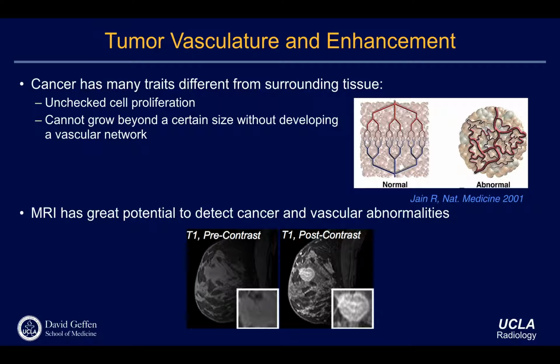Right, that's roughly right. The main idea is that whenever you have a shorter T1, it recovers faster in the longitudinal magnetization. Using a T1 weighted image, a higher signal means much more recovery of the longitudinal magnetization, so that means it has a shorter T1. I'll talk about why this area has a shorter T1, but at least when you look before and after injecting a contrast agent, you can see that certain other tissues have a lower signal and the tumor area has a bright signal, and that way you can differentiate these two tissues.